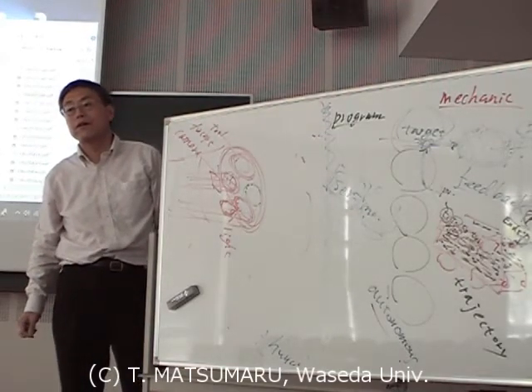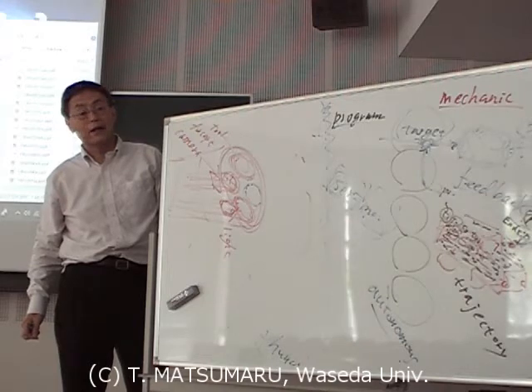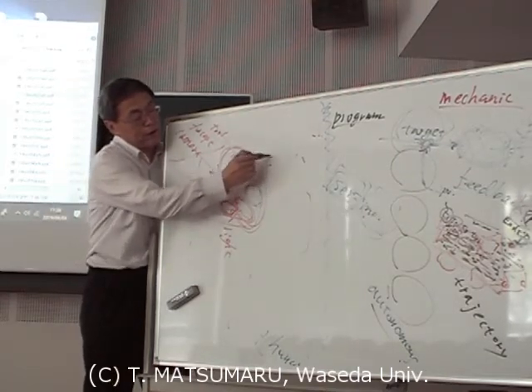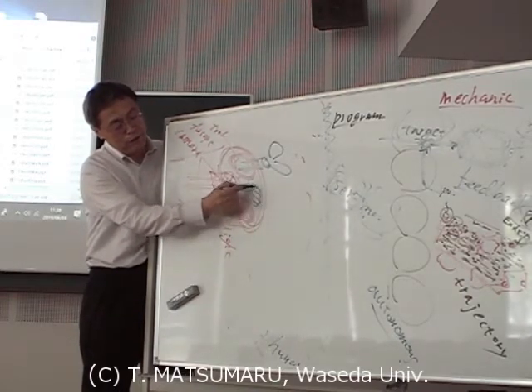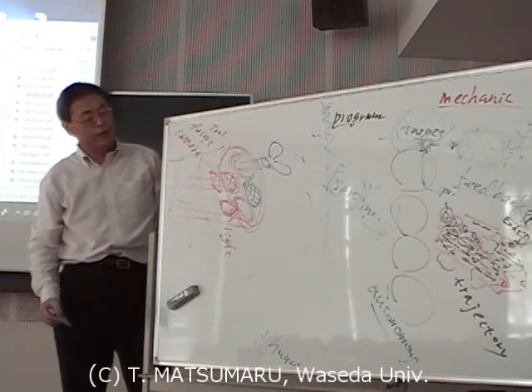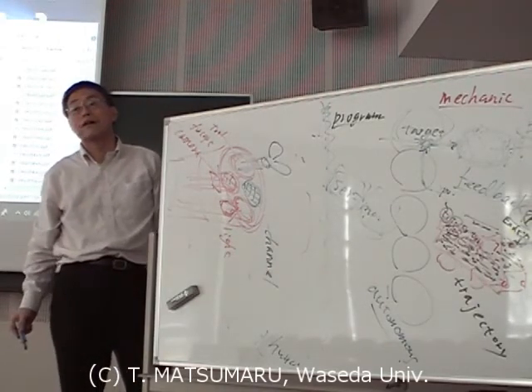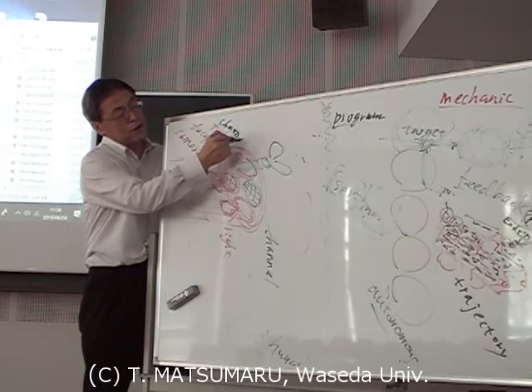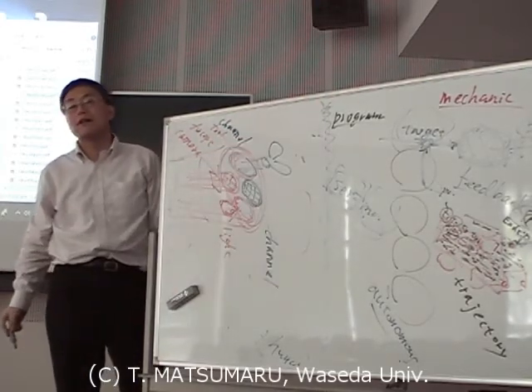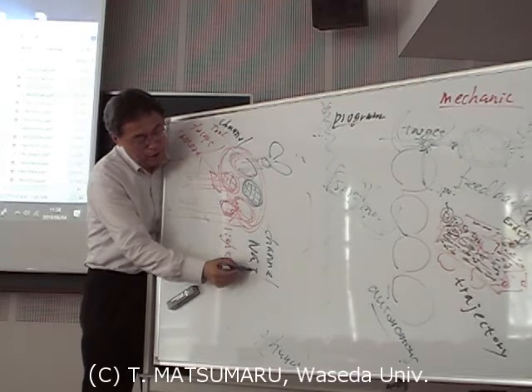How to use it? The tool comes out, like the forceps. At least one hole is necessary. What is it? One channel. So what channel is necessary? This is a channel, and this is also a channel: the forceps channel for the tool. This other one is also a channel, but what is it? The answer is water or air.